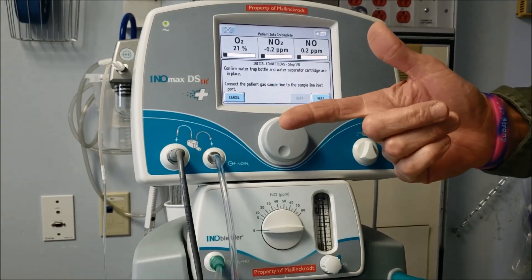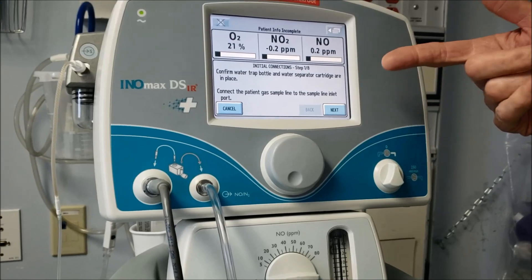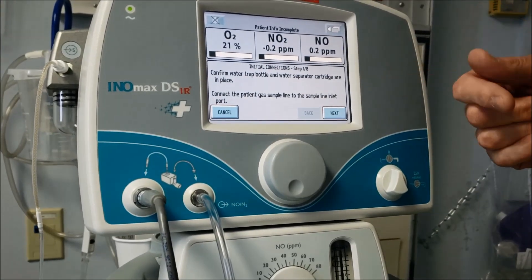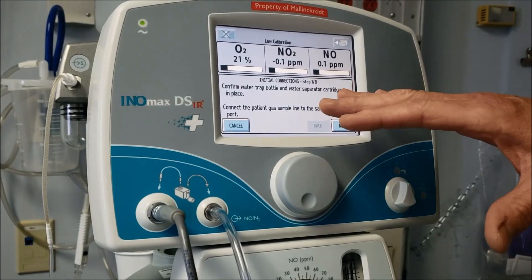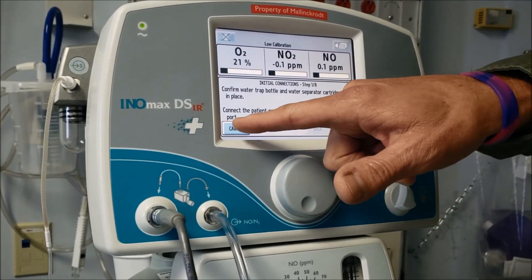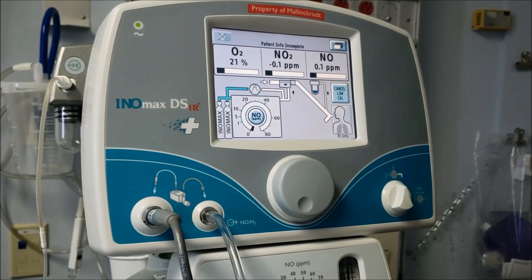After you assemble your equipment and you turn the machine on, this is the initial screen that's going to come up. And when we do a right heart cath nitric administration, we don't need to do any pre-checks. So you can simply hit cancel and you're ready to go.